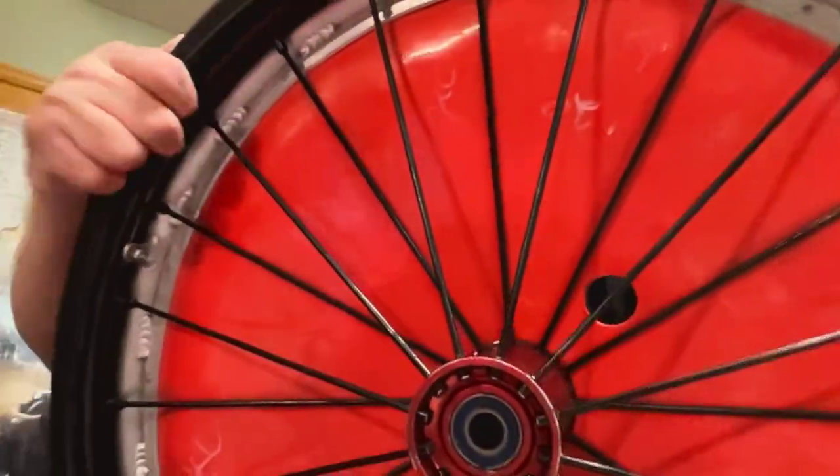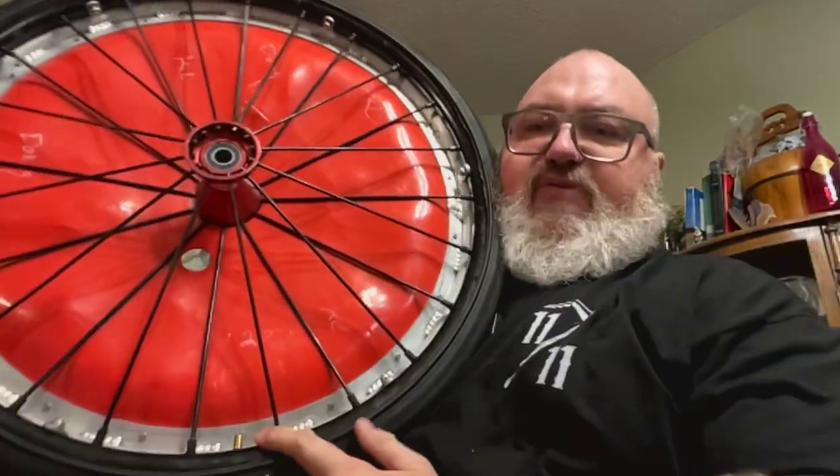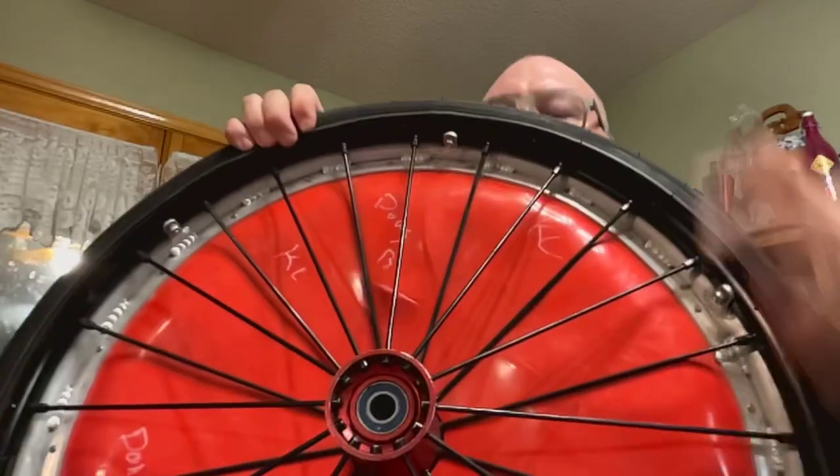And if I feel like a bevel or a bump or anything like that, I go ahead and push that tire again. Do a couple times of that. My valve stem is right there. And then I start.